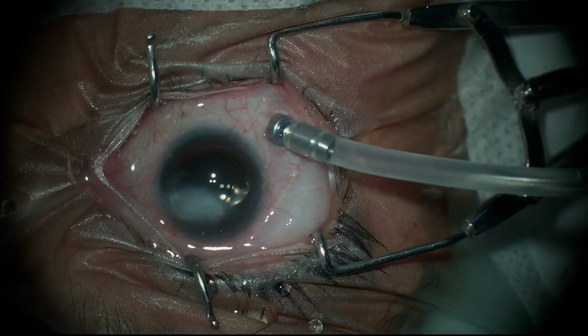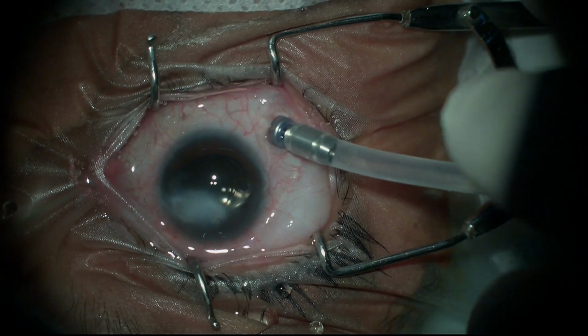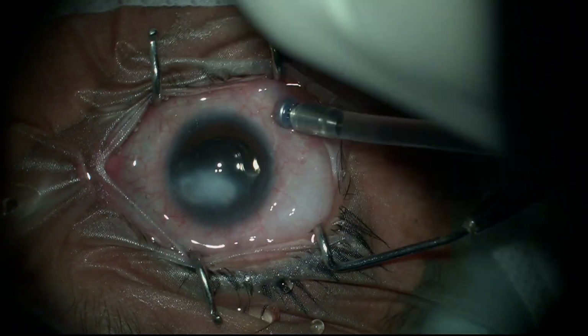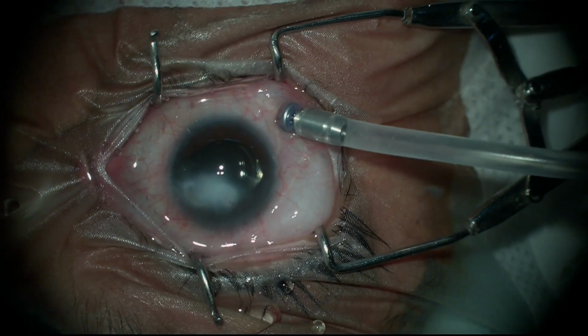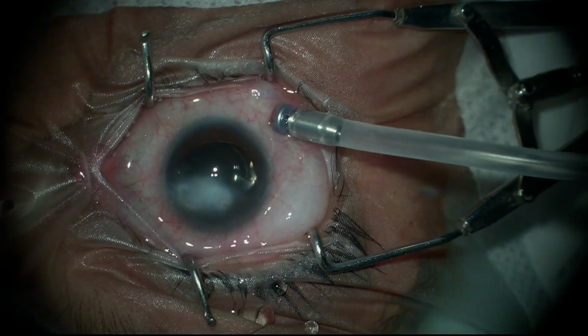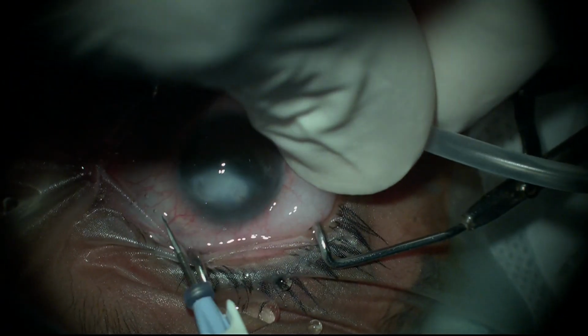The first thing you do after placing an infusion line is check for the placement. It should be in the vitreous cavity, which you can judge by looking at the cannula from inside. If it is not in the vitreous cavity, then you'll have to take care. You don't want fluid to infiltrate into any tissue other than the vitreous cavity.